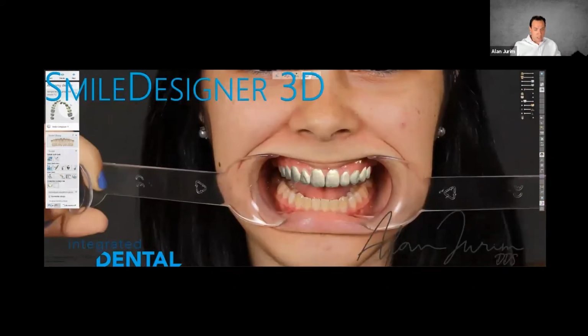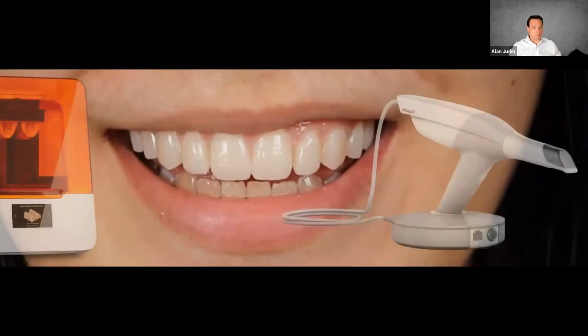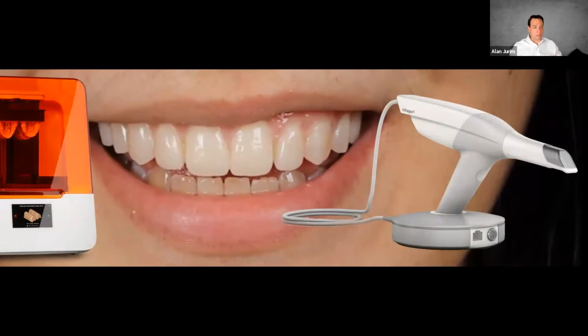If I want to change anything or visualize it, we have a lot of control. And then again, that could be printed. It could easily be transferred to the patient's mouth. And it's a very good way for us to convey the plan to the patient without doing anything permanent for that patient yet. Very exciting stuff when it comes down to digital tooth setups. And that's primarily how we use digital dental models. For cases where we're going to do porcelain buildups, for certain implant cases, or other cases like digital tooth setups where we're going to be producing appliances.